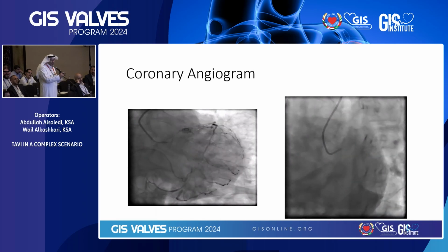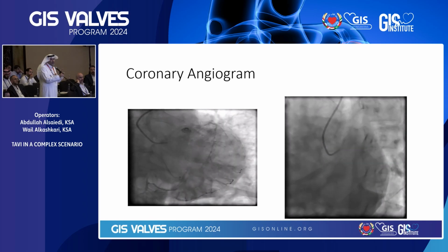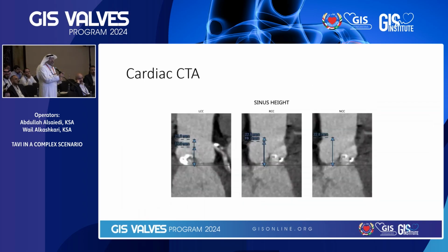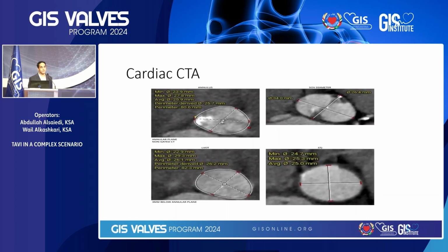You do have coronary artery disease that you need to deal with. I missed the coronary height. What was the coronary height? It was high. It was really high. And here, it was good. So on the right, it was around 19, and the left was 15. Excellent. And if you don't mind, just the age of the patient. 76. And you have an area of how much?